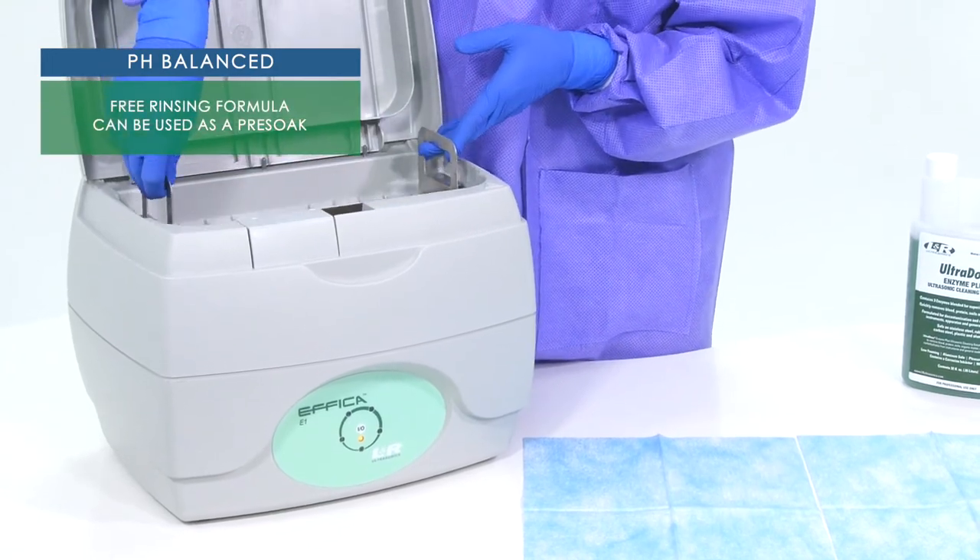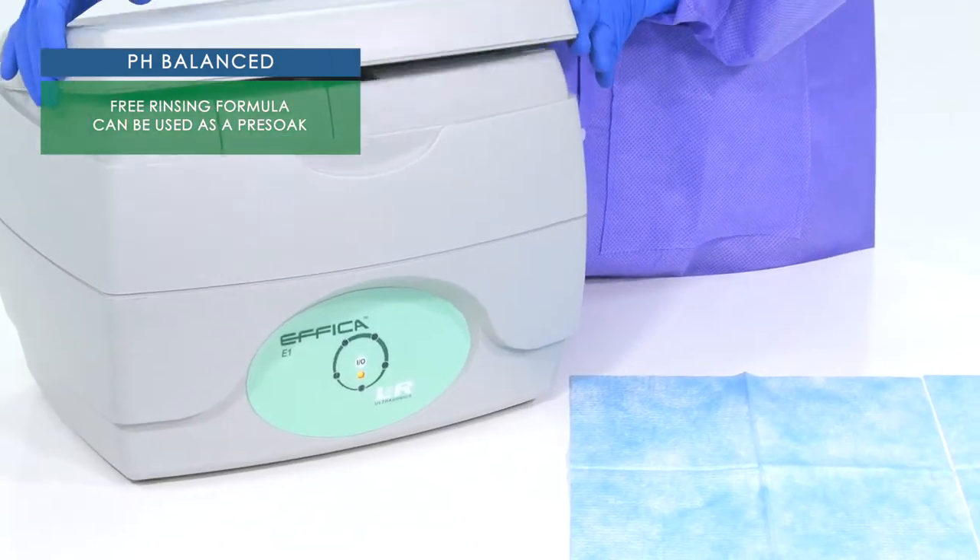The pH balanced and free rinsing formula can also be used as a pre-soak solution.